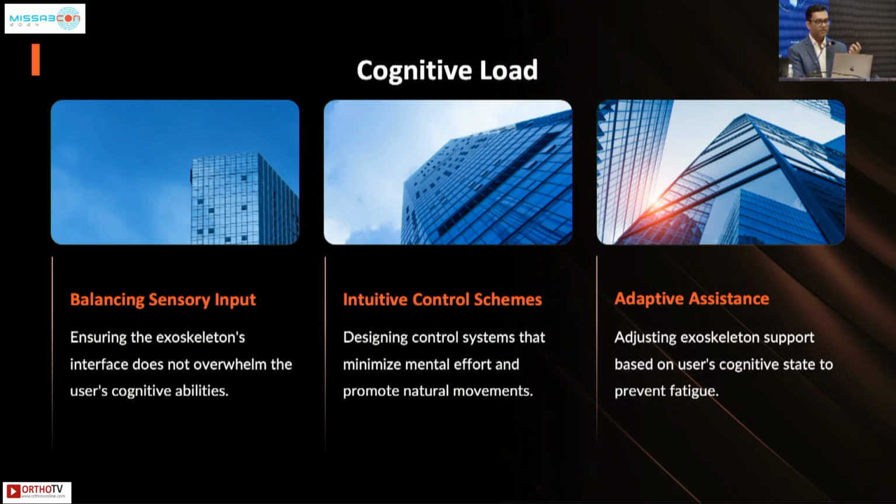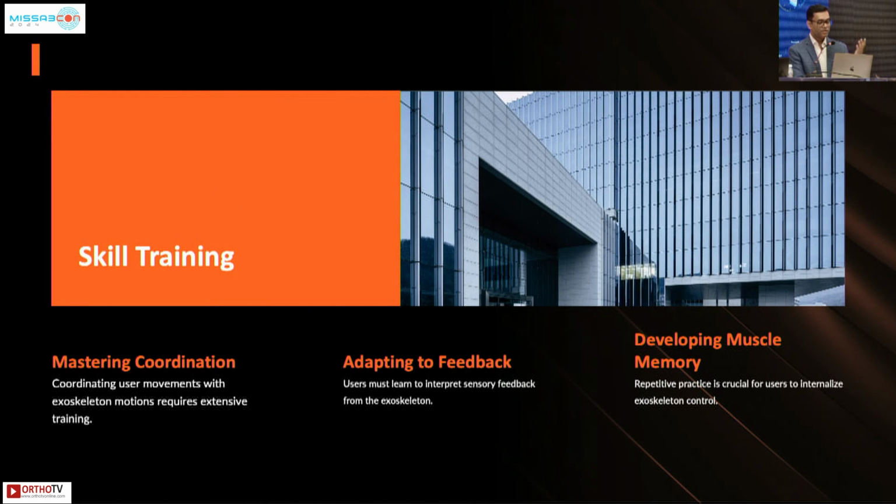And adaptability, what is the disability of the patient? What is his level of injury? If he's got hand function, but say a C7, T1 injury, can this be used across a C7 injury with the minimal hand function? So skills training, this is the most important.